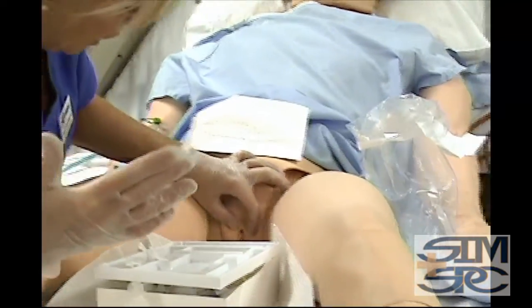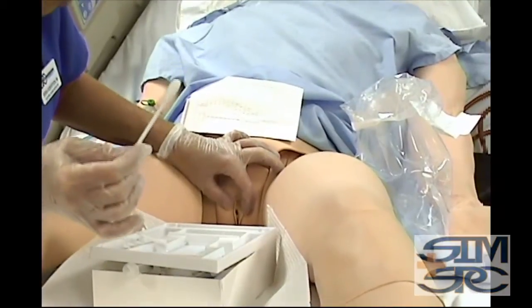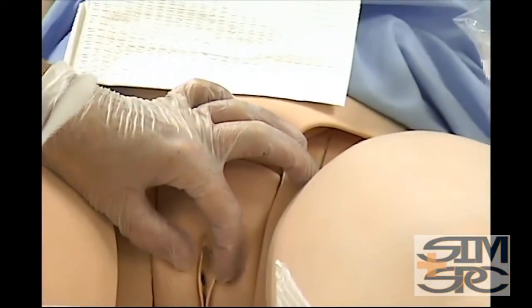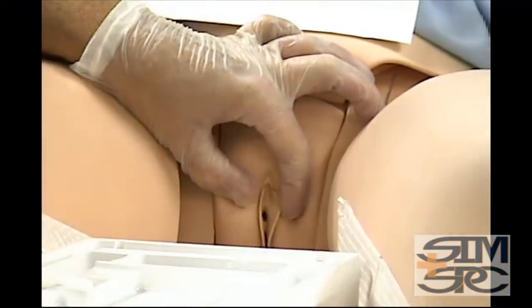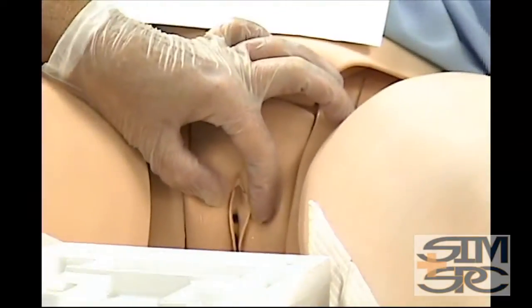You're going to visualize where you're going at this time. So now you're ready to take your swabs with your cleaning swab, and you're going to clean, because you have plenty, the majora. So you're going to go the farthest away and clean the labia majora. You can cross and do this. Don't cross over the field this way. Try to do it this way.